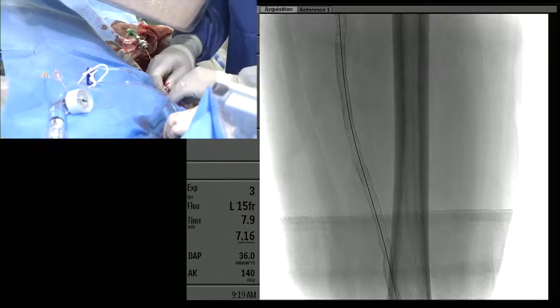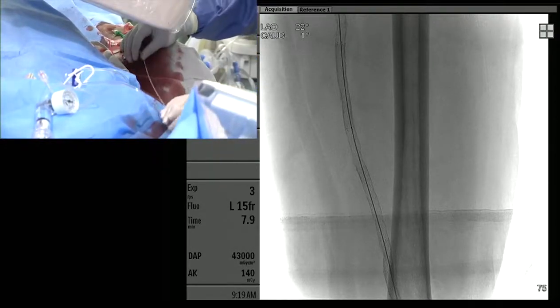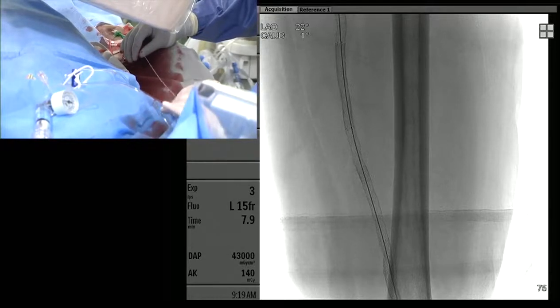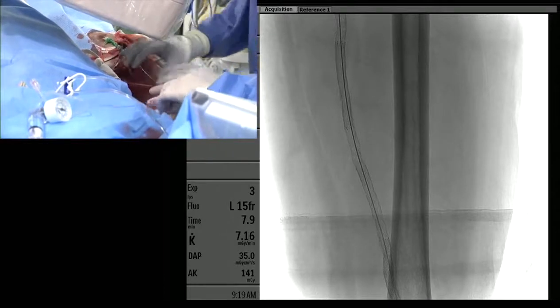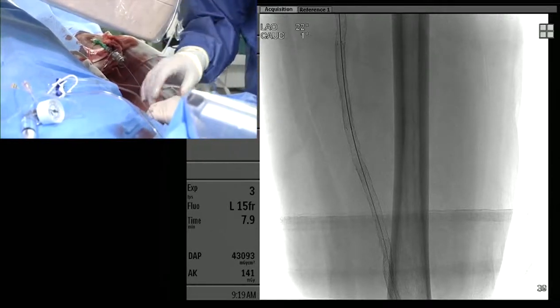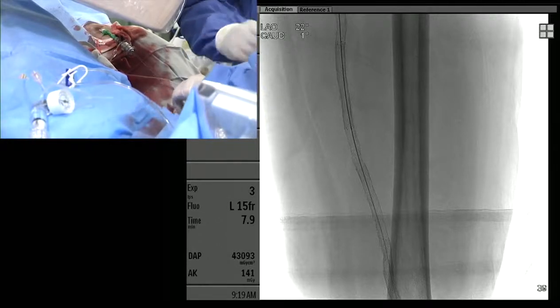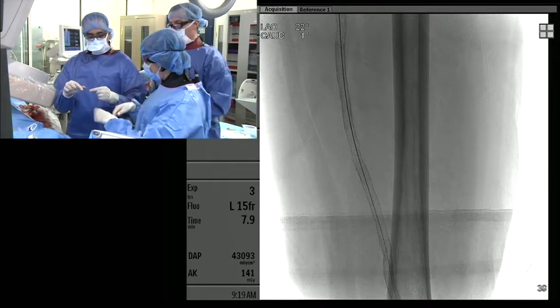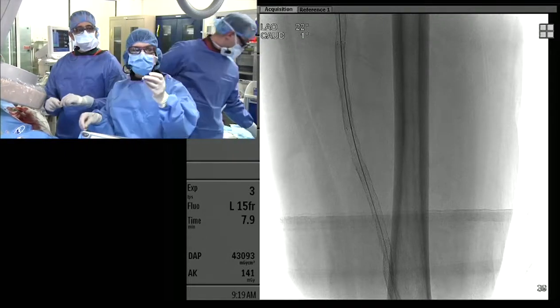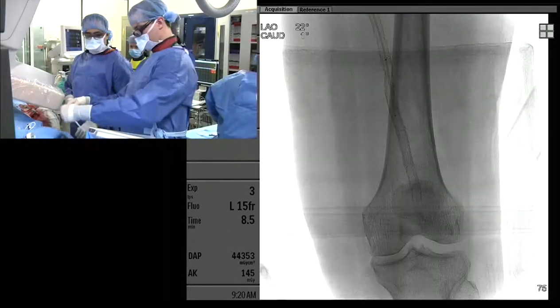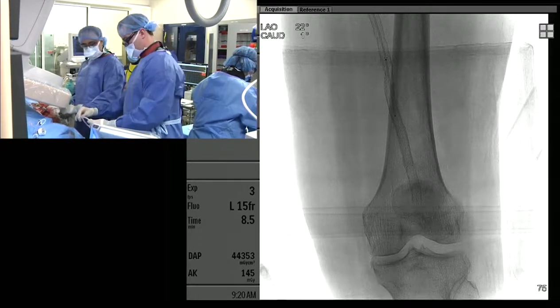Can we get the Nanocross? This is real life — you're getting real-life experience, and it's valuable to see how these problems are solved. That's the real value of watching live cases. You still need the long wire. We're going to exchange this out for a long V18, 300 centimeters, to get a little bit more length. We were literally short by about 10 centimeters.